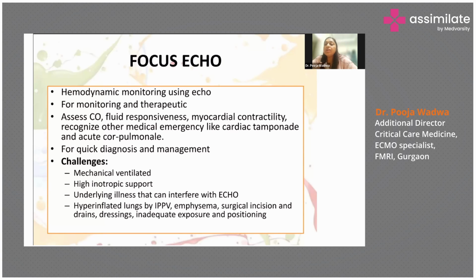Plus, the need for an immediate diagnosis without a detailed echo is very high. So intensivists are now fast adopting the focused echo scan, especially in patients where you require hemodynamic monitoring.